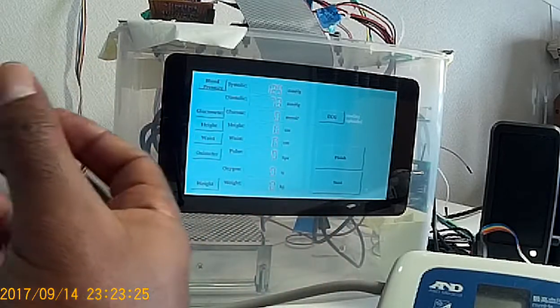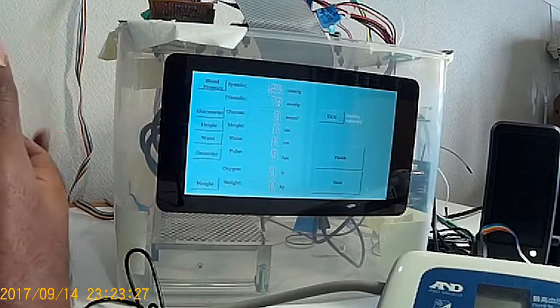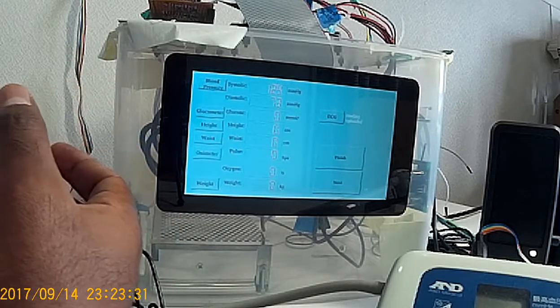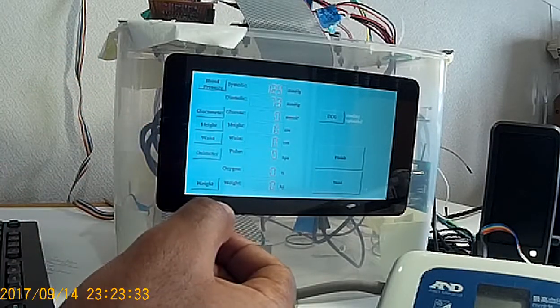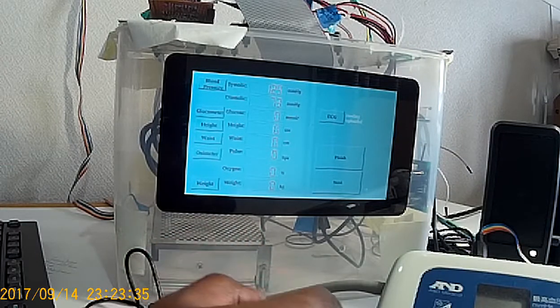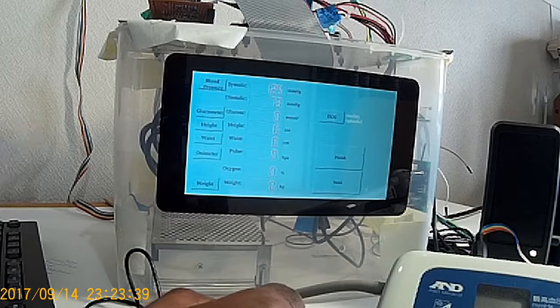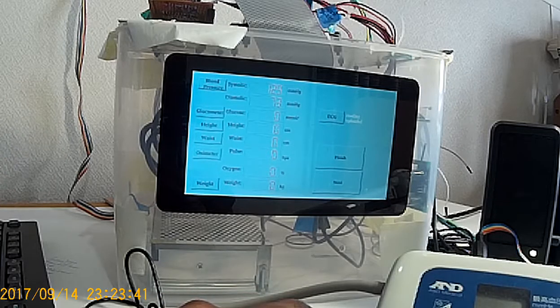Comparing what changes are happening along with what factors were contributing to that at that specific time. If we could remember what we have been consuming, our lifestyle at that point, and so on. Have we been doing some exercise, or have we stopped exercise lately, and what are the things which came after that, and so on.